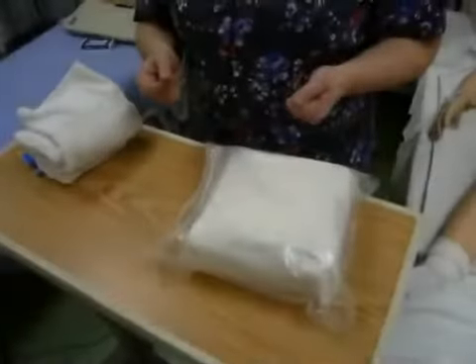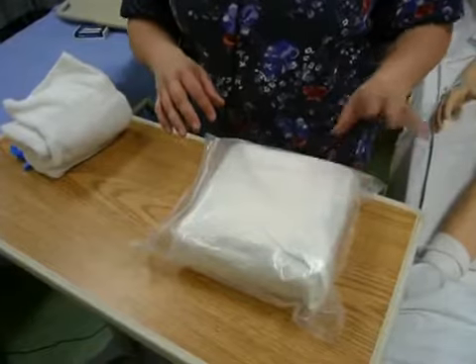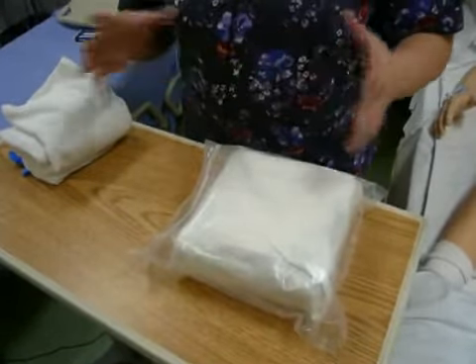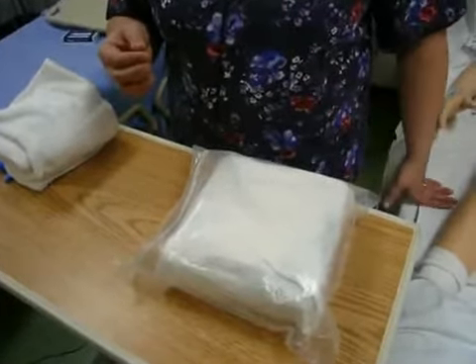Male catheter insertion. First things you need to do is to check your patient's orders, make sure you have the right patient, make sure you've explained the procedure to your patient, and then you need to make sure you gather your supplies. I also have made sure that my patient is ready. The bed is at waist height.